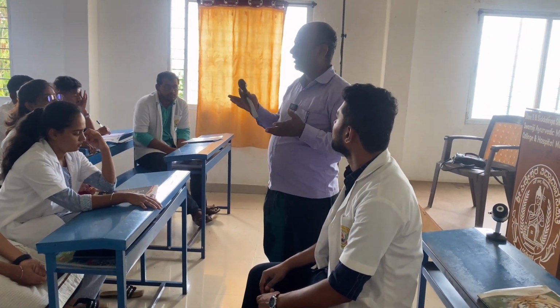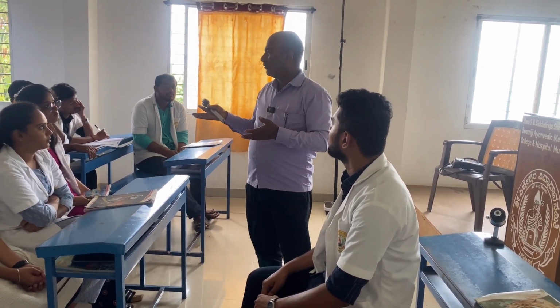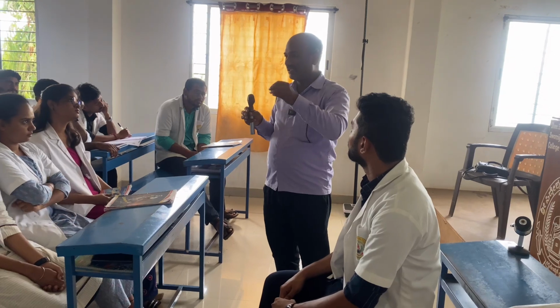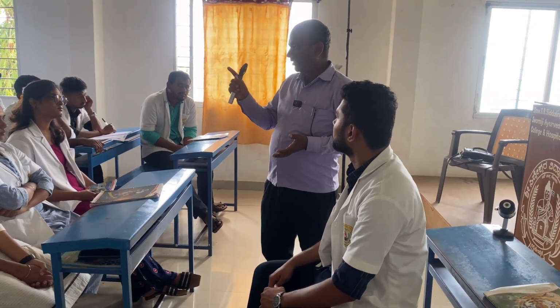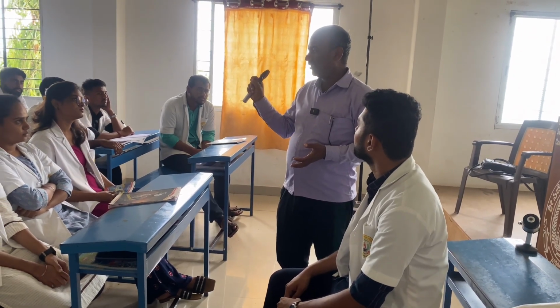Obviously, arteries and veins carry blood, and in vasculopathies like diabetic retinopathy, these blood vessels start leaking and give out blood. If that blood is in the initial stage, it will look like a soft exudate. एक बहुत छोटा सा ड्रॉप गिर गया, that looks as a soft exudate.